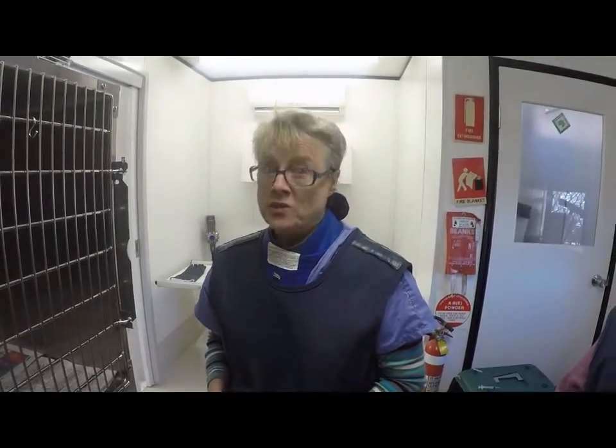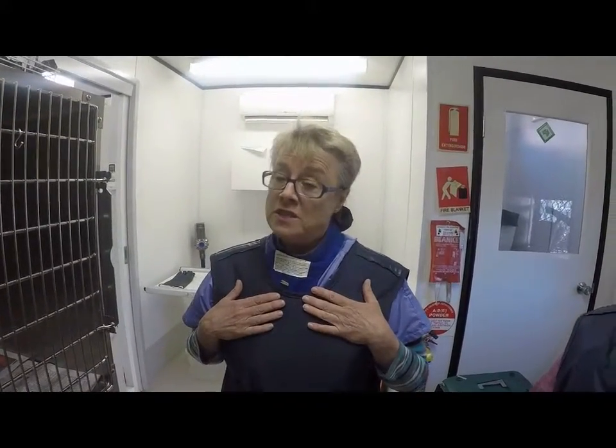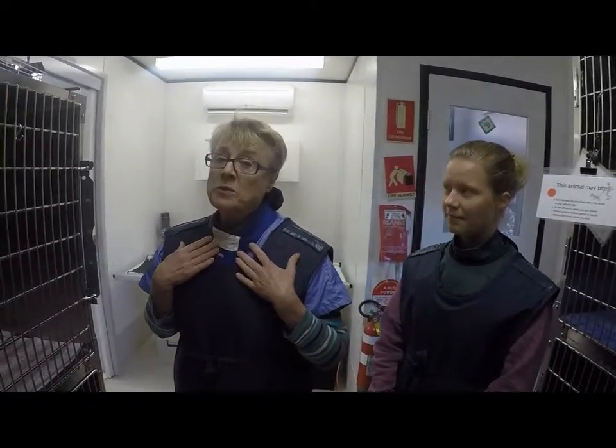Hi, I'm Luke from Gunnedah Pet Lit and we're about to show you our new x-ray equipment which we're very proud of. We're dressed, both Sizzle and I, in some lead-lined aprons and thyroid protectors which are also lead-lined to protect us while we actually take x-rays of the dog.